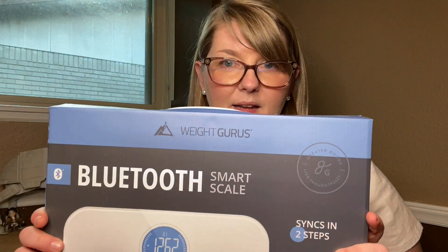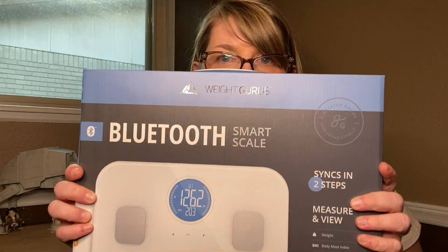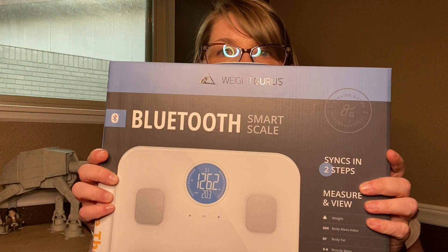The scale that I picked up is the WeightGurus Bluetooth Smart Scale. This scale has some pretty neat specs and it does everything that I was looking for. It will sync up with my Apple Health or Fitbit device, and also Google Fit and other popular apps. It has the ones that I use, so that's what I care about.